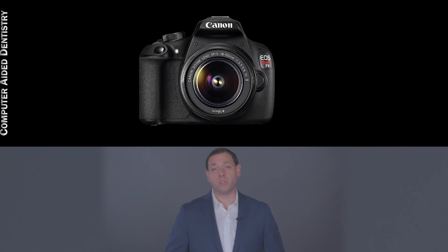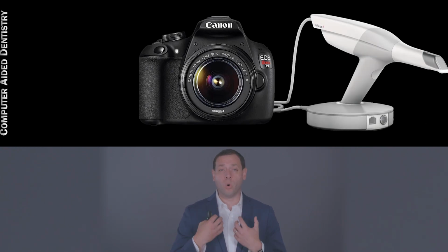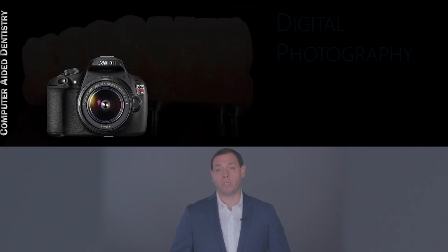But the other foundational tool for digital dentistry has been an intraoral scanner, a way that we can record what we like to say a surface scan within the mouth. The last major tool, or the fundamental tool that we always use, was 3D imaging, a way to see below the soft tissue and use that information to help plan for sleep apnea appliances, surgical guides, but it gives us an incredible amount of insight into complexity before we ever actually begin treating a patient.